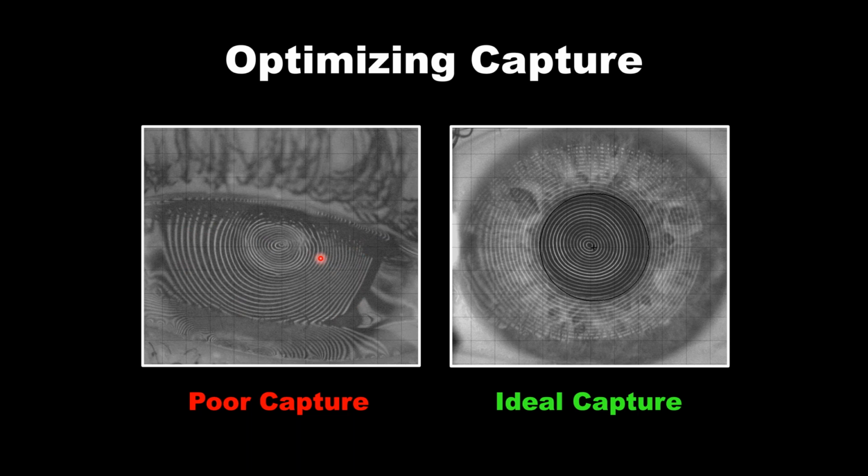As an example, if this is the flat meridian of the eye, if it's a truly with-the-rule cornea, we don't understand our landing here at 3 o'clock. We may understand the landing at 9 o'clock. If we're trying to build a toric lens for an astigmatic eye, we have no understanding of the depth needed, where the lens will actually land in the vertical. So get the eye open as wide as you possibly can.